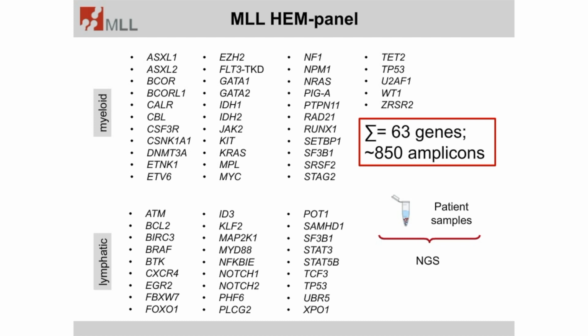And the other reason is that many patients, especially in the reference laboratory we are running, which serves a lot of patients in Germany, they are not quite sure what the patient has. So the question may be unclear anemia. If you just address, let's say, 3 or 4 or 5 genes from the myeloid panel, you may miss the BRAF mutation that would demonstrate to you that the unclear anemia is caused by a hairy cell leukemia. And so we decided more than a year ago to put all these genes in one approach, in one assay.